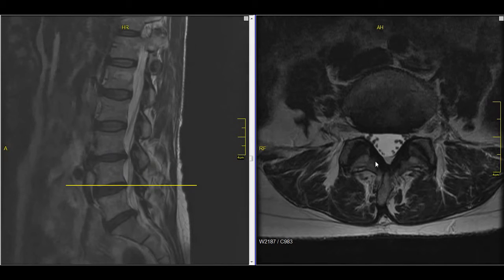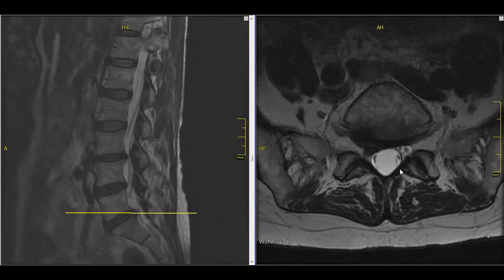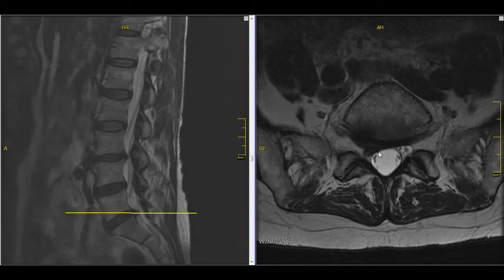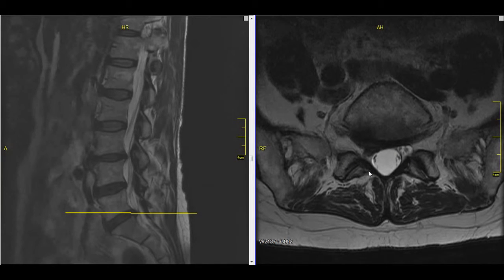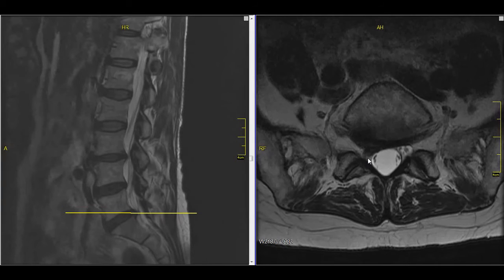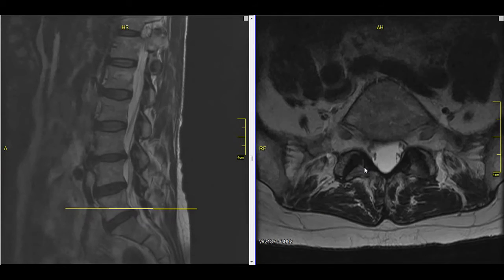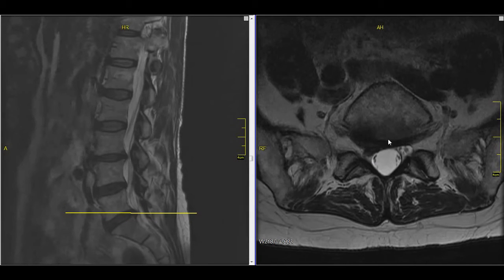Here's L4-5. Once again we see the two nerves in the corners and they're okay. But watch what happens when we get to L5-S1 — we see that thing right there. Here's the S1 nerve root on the other side, and the S1 nerve root on the right side is right there. So this is a piece of extruded disc material that's not large, but it's right under the nerve root, compressing it up against the bone. This would cause sciatic pain, or pain down the back of the leg. Scrolling back and forth, we can see the nerve above and below — there it is being compressed, and then it emerges further down.